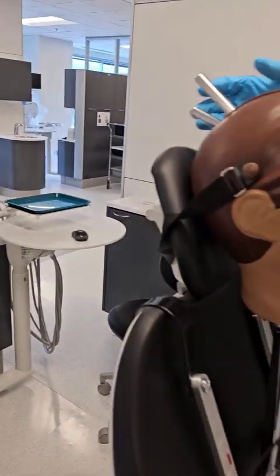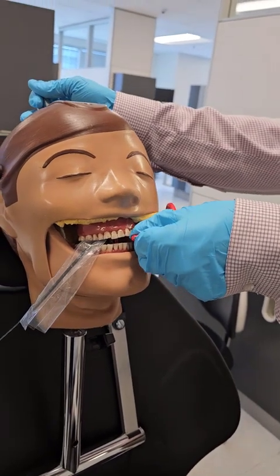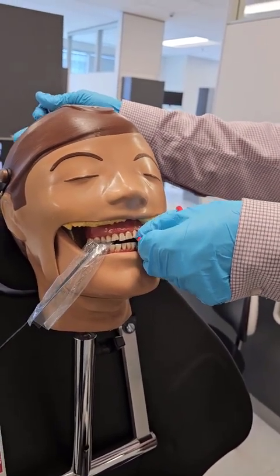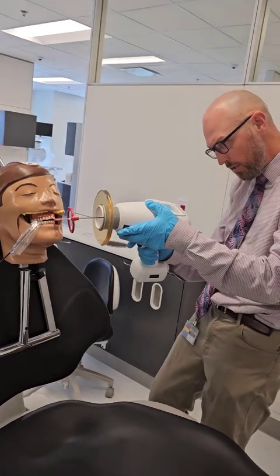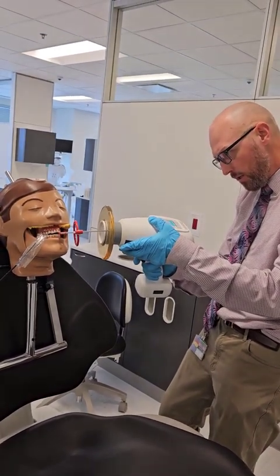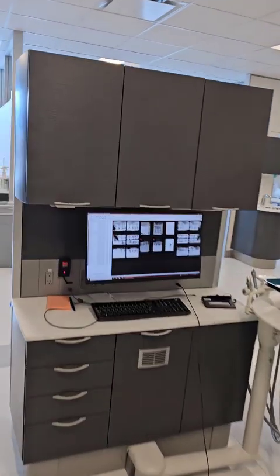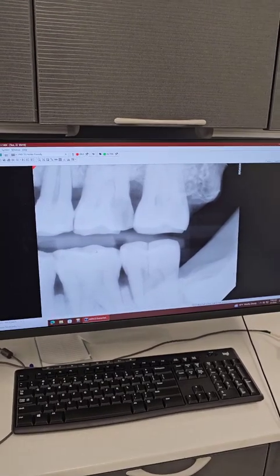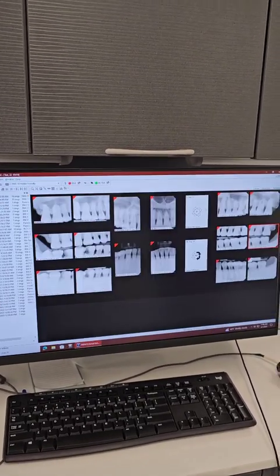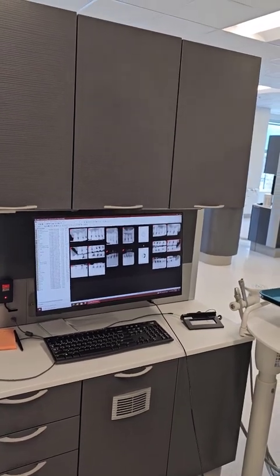Let's take a molar shot. If he's tolerating it, I'll just slide it back — distal of that first molar if I can, right between the first and second molar. I'm coming a little more distally to try to open up the contacts of the molars. Pretty even levels of bone, this is right in the middle, pretty open contacts as much as I can with this mannequin. So that's your FMX in less than 10 minutes — I just didn't do the canines on the left side, but that's pretty much it. Thanks.